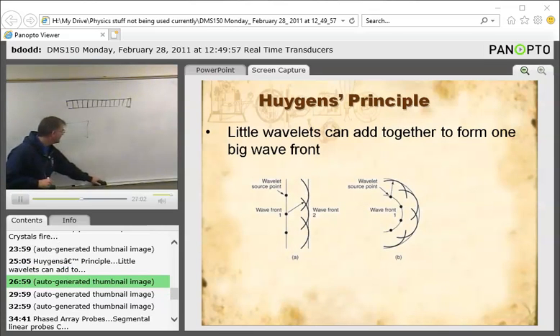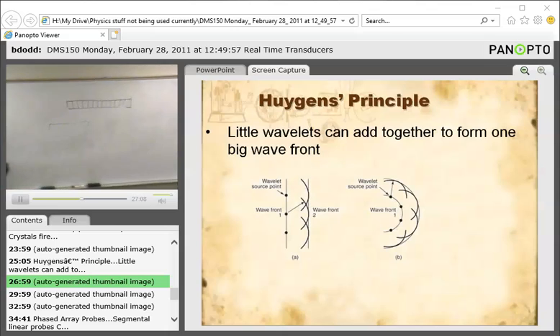Yeah, you turn your knob. But we're talking about a single crystal. I'm the manufacturer, and I want this to focus very close to the skin. I could use a curved lens, correct? Or I could use a narrow diameter, right? Now, don't confuse thin with narrow diameter.